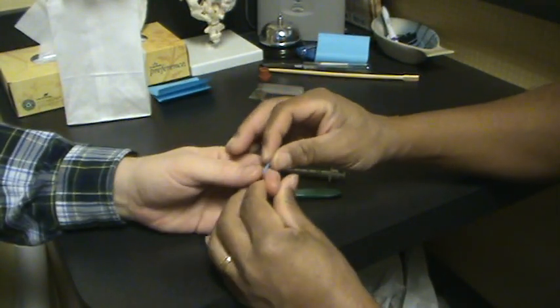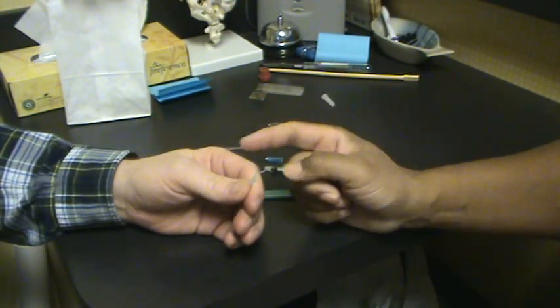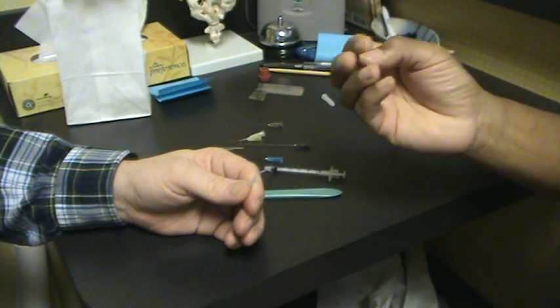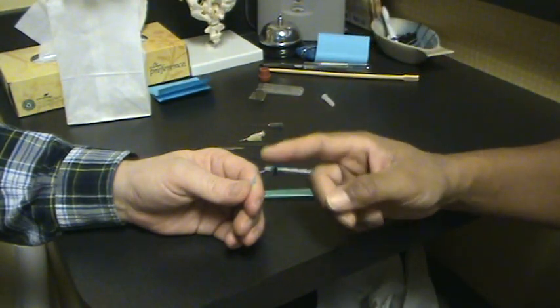Bring your hand over here and just hold that needle for me. I'm going to pluck it — you can feel the vibration in the needle. The vibration is very important because you can sense how dense the tissue is, or how stiff it is, based on the feedback from the needle.